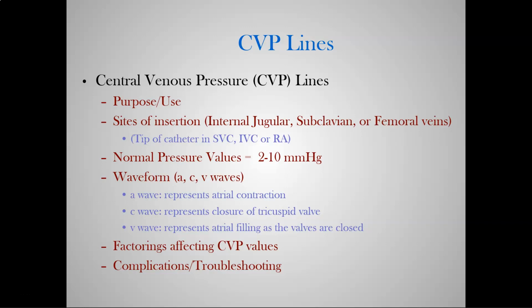The idea here is if your numbers are too low, and by the way, you can never have a negative reading. I had a nurse one day come up to me and she's like, "Yeah, we have a reading of -7. I think he's in a fluid volume deficit." I'm like, well, it's not a thing. You can't go below 0 because that would mean you have no fluid. There's nothing below 0. -1 doesn't mean you owe me a liter of fluid. It means you don't have anything inside of you at all. 0 is the lowest you can go.